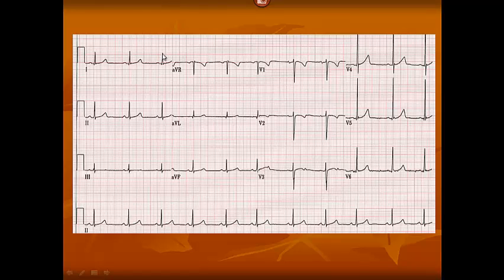or add. In other words, if this is 60 and you know that the next number will be 50, you could either add by, if you know that there are 5 tiny little boxes inside, okay, and if a big box measures 0.20 and each tiny little box is 0.04, you will be adding by 4 because 5 times 4 is 20.